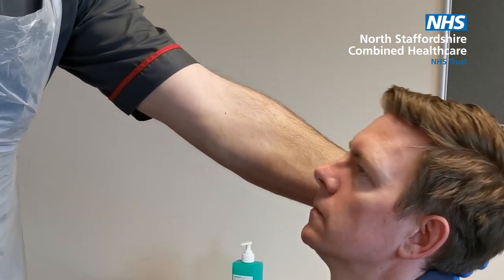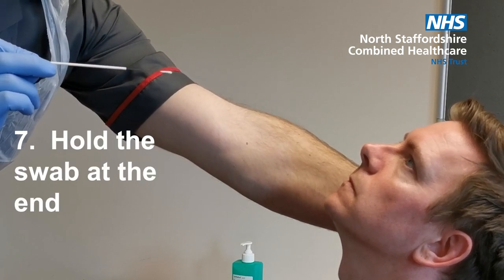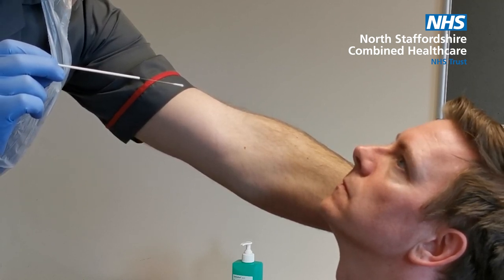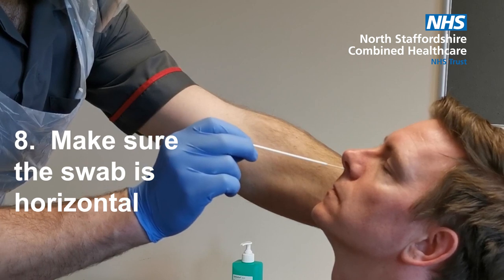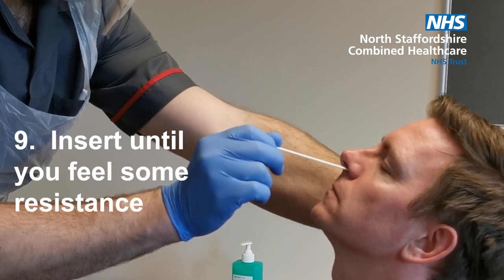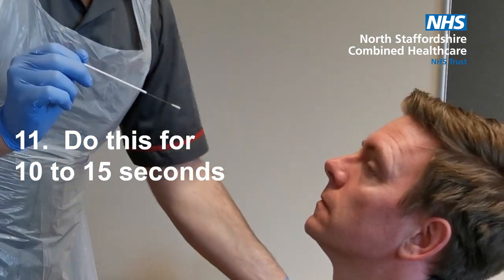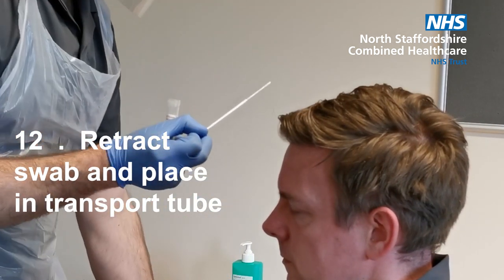Ask the person to tip their head back and support the back of the neck if required. Note how Rob is holding the swab at the end — this is important because you will be required to snap the end of the swab when it goes into the transport medium. Also note, when Rob inserts the swab, how it's horizontal. Insert until you feel some resistance and then slightly twist or rotate, going slowly at this point. It's recommended that you do this for 10 to 15 seconds. Retract the swab and place it in the transport tube.